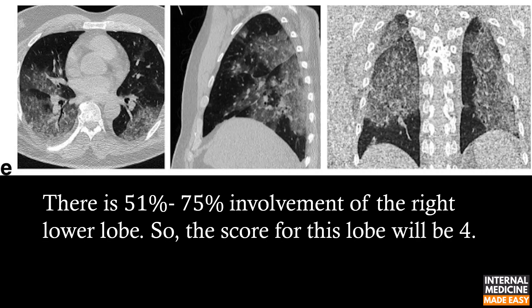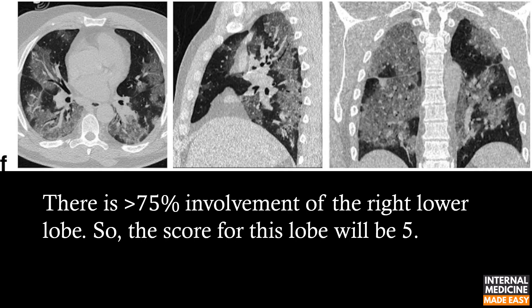Here there is 51 to 75% involvement of the right lower lobe, so the score for this lobe will be 4. And in this CT, there is more than 75% involvement of the right lower lobe, so the score for this lobe will be 5.